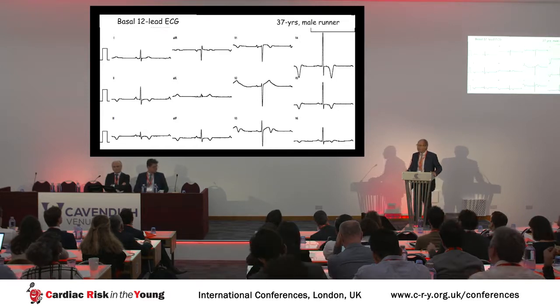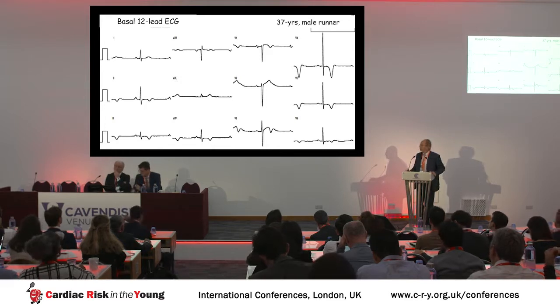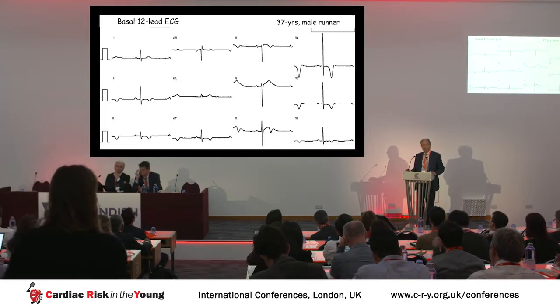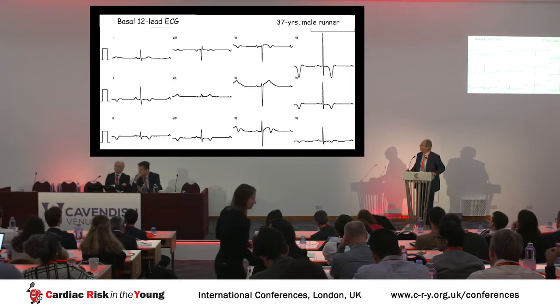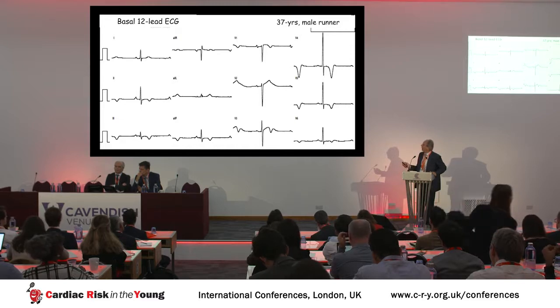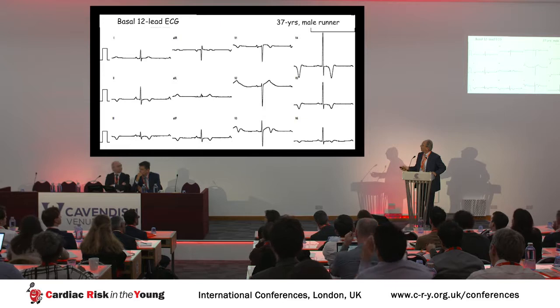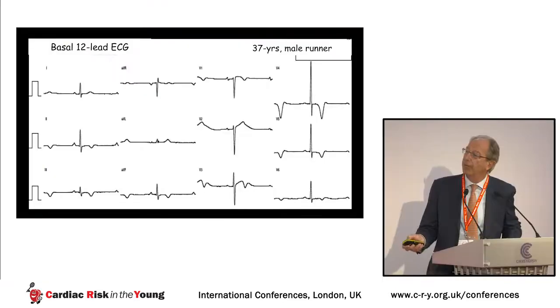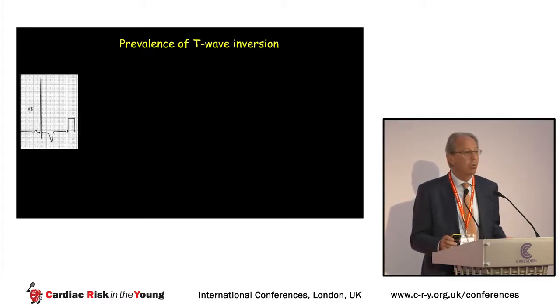And so the main message for this 10-minute lecture is that in front of one electrocardiogram, such as the one shown here, showing clearly abnormal inverted wave in the lateral, inferior and lateral leads, the main message is to look for underlying cardiac disease.